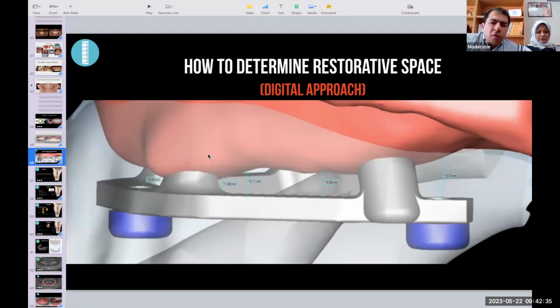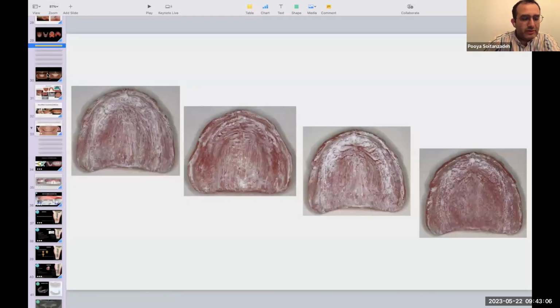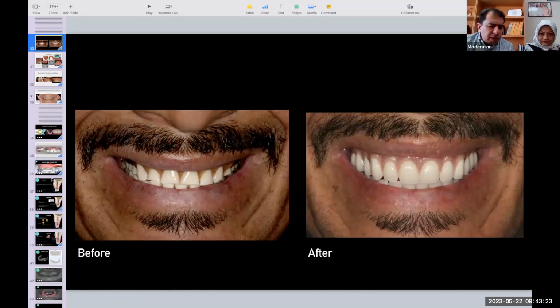There was a former question regarding the Facebow. How do you manipulate the Facebow for this type of digital complete denture? So this company had a ruler that you can use with a certain amount of measurements on it. Let me see if I have a picture of it. It's somewhere. I will show you. But also you send them the photos as well. And nowadays, are you familiar? Have you heard about Rayface? No, I'm not familiar with that.